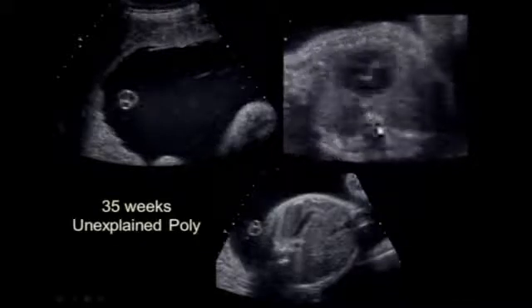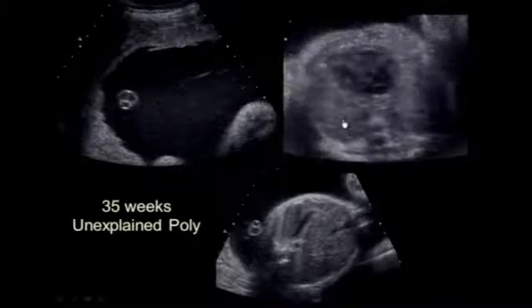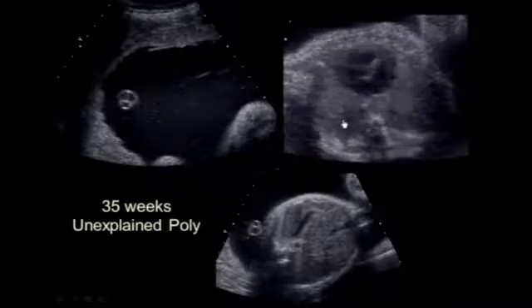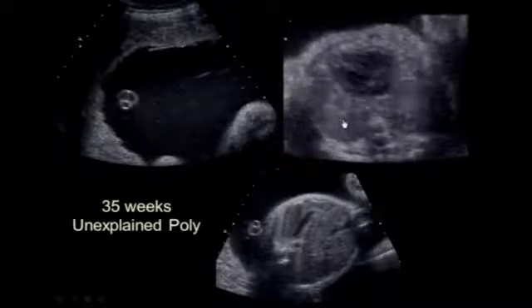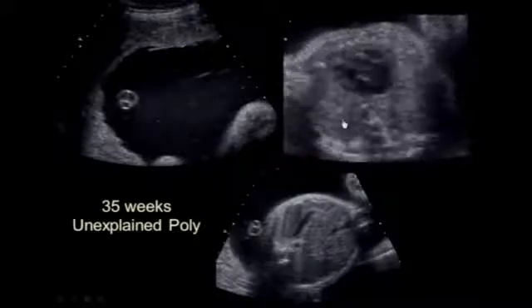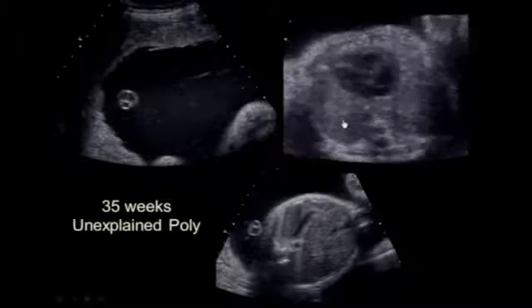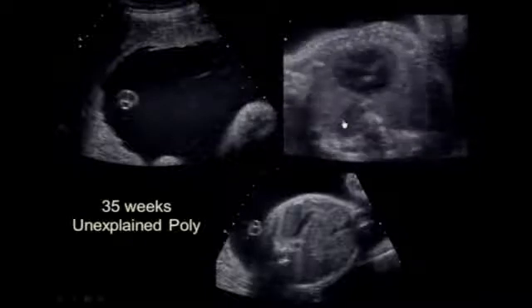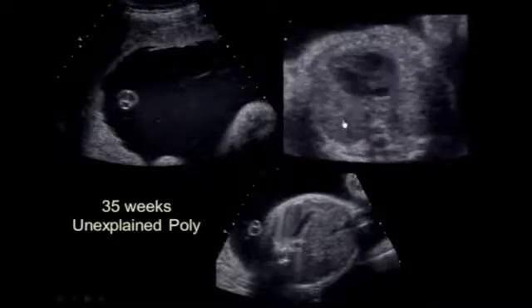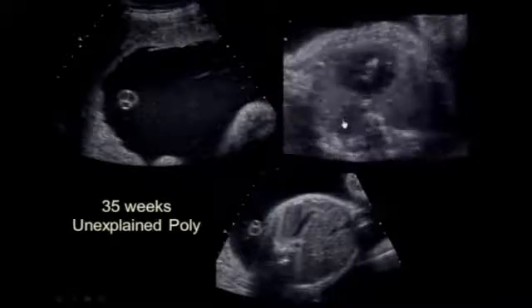But why don't we see the big distended lungs from the tracheal atresia? Well, in addition to the tracheal atresia, there was a fistula from the right mainstem bronchus to the distal esophagus, to the end of the esophagus beyond the esophageal atresia, and so the pulmonary fluid was able to decompress down into the stomach. So it gave us a normal lung appearance, a normal stomach, and yet impossible for this fetus to survive.